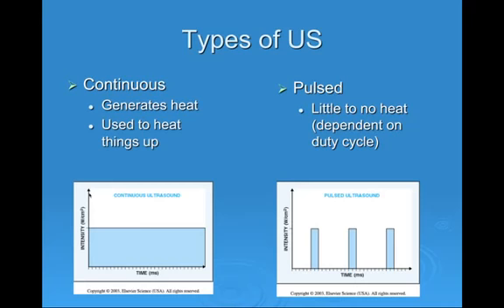As you can see, as my duty cycle goes to 100%, it approaches continuous ultrasound. So when the duty cycle gets higher and higher, it is going to produce heat. So pulsed ultrasound, though, is typically only used at 20%. So just keep that in mind.